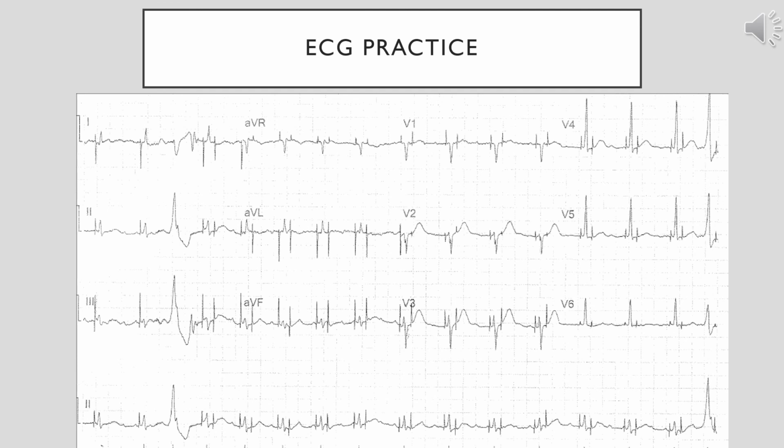Failure to sense is where the pacemaker is failing to sense that there's a need for a pacer spike. So, if you have a patient that relies on a pacemaker and the pacemaker isn't sensing that conduction is necessary or needed, then the patient isn't being paced even by the pacemaker. So a lot of times patients with pacemakers may need evaluation, especially if they come in with shortness of breath, syncope, lethargy. These are some symptoms that someone like this might be experiencing when they come into the office.